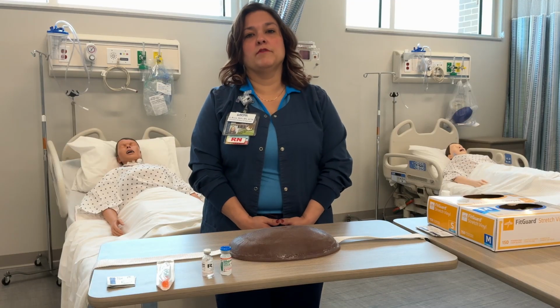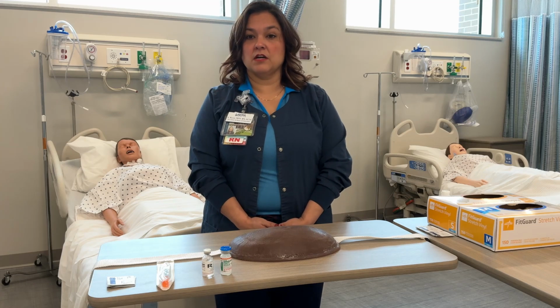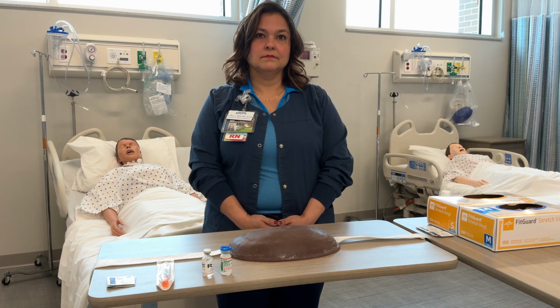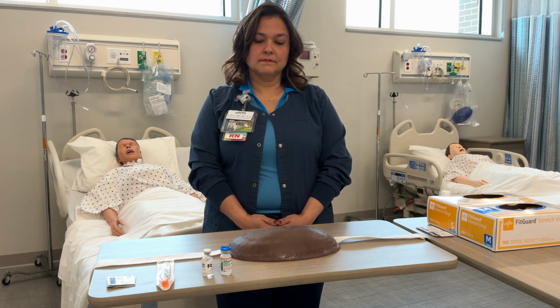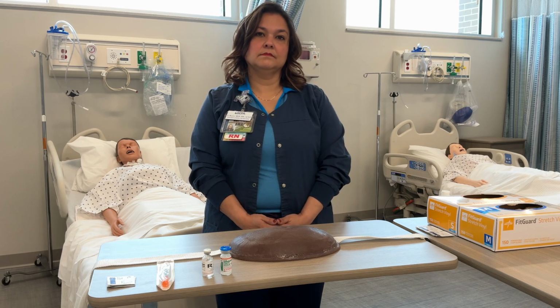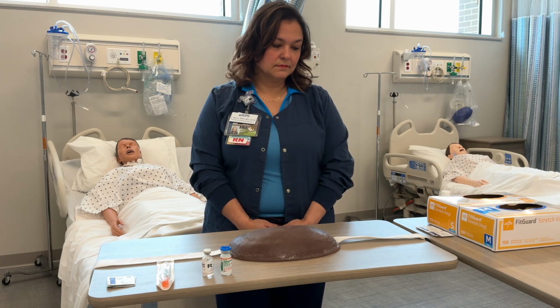We're going to be going over your subcutaneous and insulin skill. But first, before we get into the actual skill itself, we're going to go over some of the sites. There's quite a few common sites that you can give a sub-Q injection for, but I want you to remember that you need to be looking at your patient. You're giving this injection into subcutaneous tissue, which is fat tissue. So if you have a larger person that has more fat on them, these are going to be easier to find than someone that's smaller and has less fat. So you need to make sure you're injecting into the fat layer.